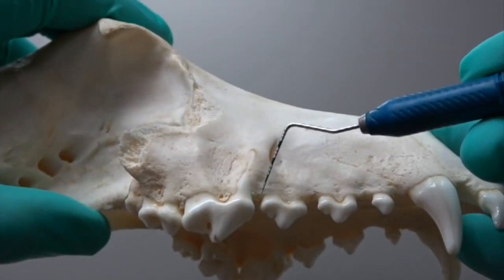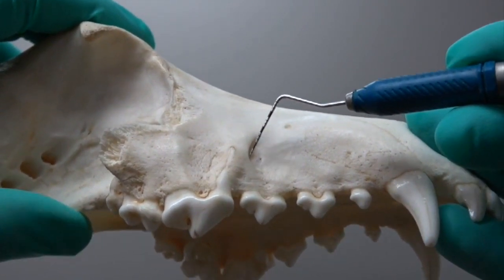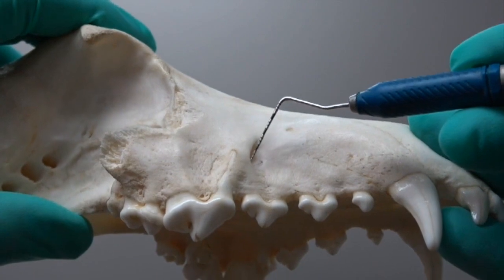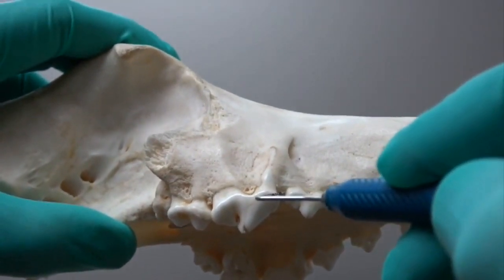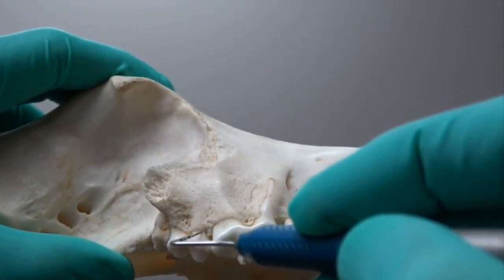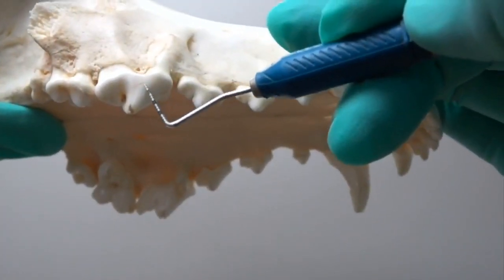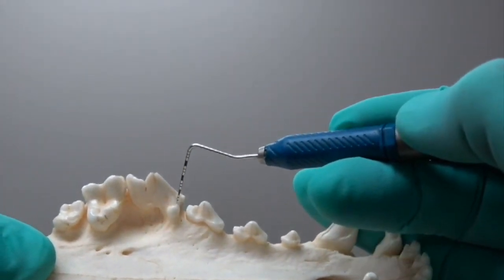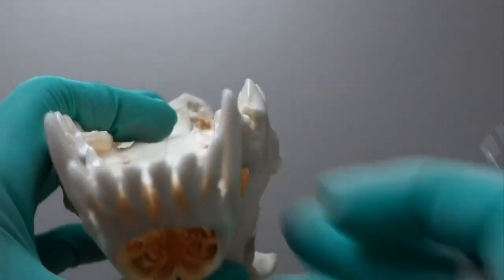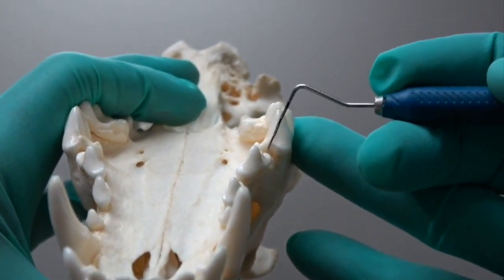The first landmark is the distal aspect of that third premolar, right at the line angle. We're going to diverge that incision slightly to keep it out of the way of that root and not get too far up into the infraorbital foramen. Then for the envelope flap, little stab incisions starting at that third premolar and stopping at the mesial aspect of that first molar. There's your section for separation of the vestibular and distal root, and your section of the palatal root from the vestibular root. When you turn that over, you can see the actual furcation — there's gum tissue in that area in the live patient.